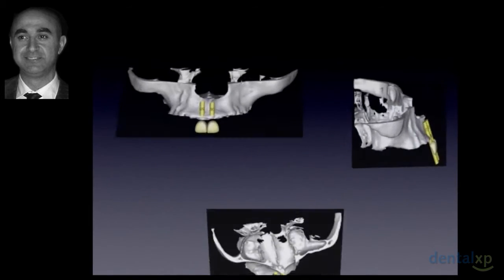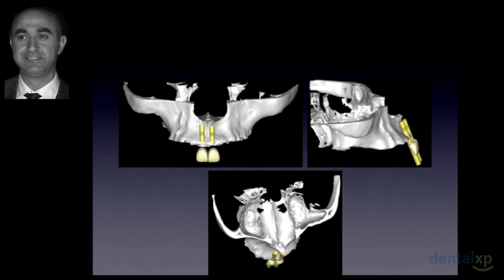But when we look at the 3D rendering from the Simplant software, a virtual planning of placing the implants according to the wax-up, according to the proper occlusion, you can see that the whole body of the implants are actually out of the bony housings.